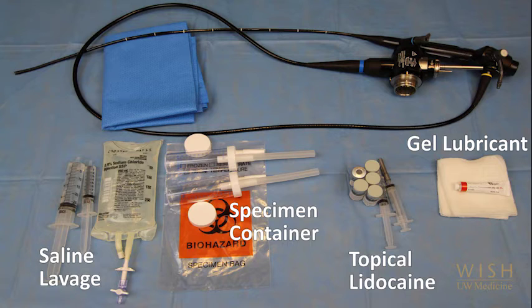Pre-procedural preparation is important to the success of performing BAL. Therefore, it is important to ensure that the appropriate equipment necessary is available and easily accessible. Key items are shown in this labeled photo. A light source, a video monitor if needed for the bronchoscope, and equipment for suction tubing to attach to the scope are required, but are not shown here.